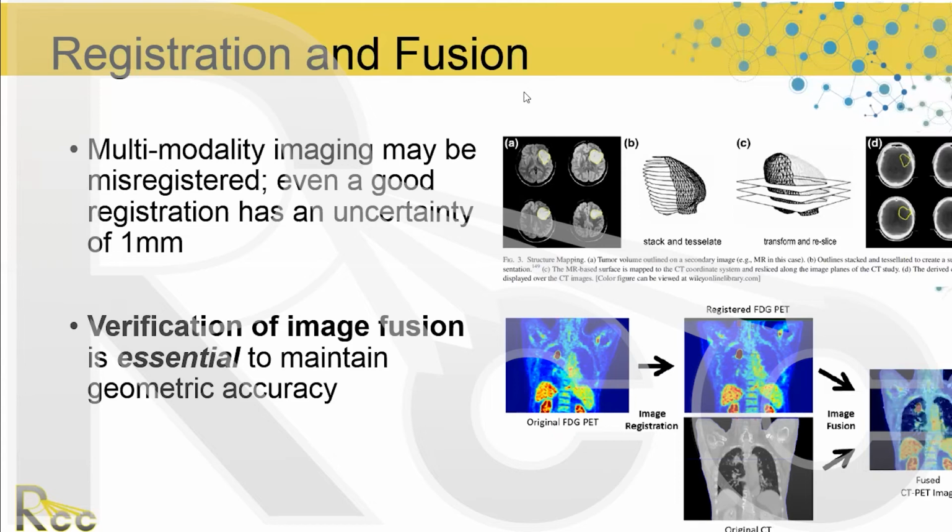However, that is hard, and it might be better to line up to something else that you can see clearly next to the tumor, like one of the major blood vessels, for instance the celiac artery or the superior mesenteric artery, or if there's a fiducial marker, even better. That's easy to see. I hope that helps clarify things, Soha and others.